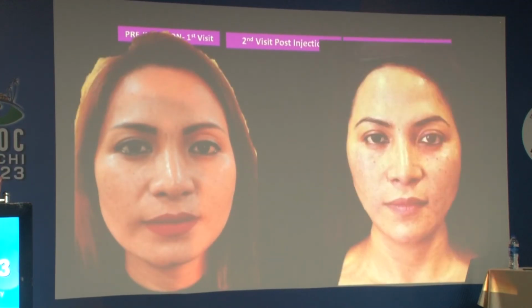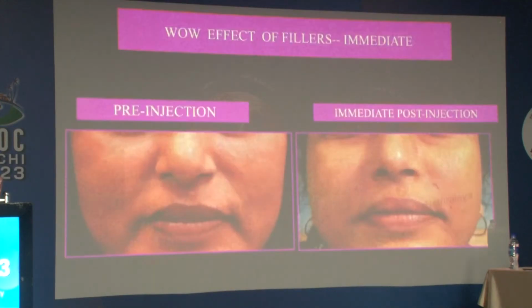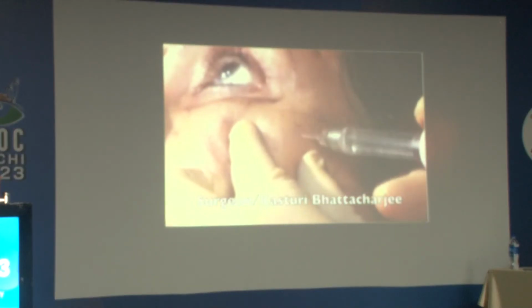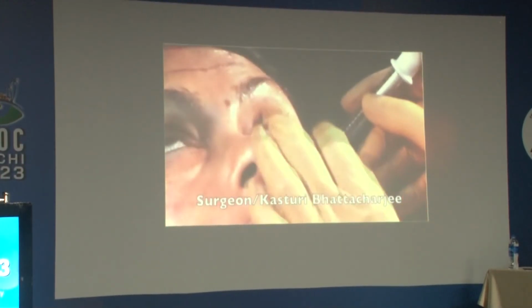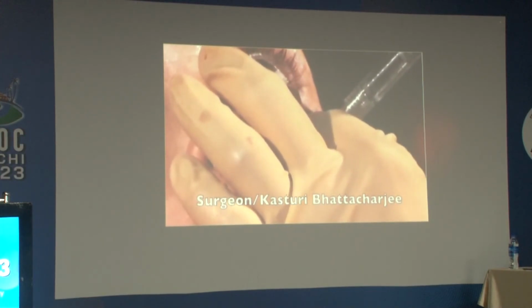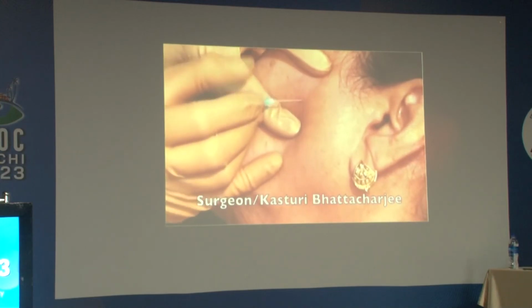Another indication which has become very common for all of us is the nasolabial fold and the lips. It really gives a very good fill up. As you can see here, this is a short video. I'll finish it in 1 minute. This is a short video of the whole face filler where you can see the classical point in the zygoma I'm giving in the mid face region. Then I'll give in the preauricular region in order to lift the face further.